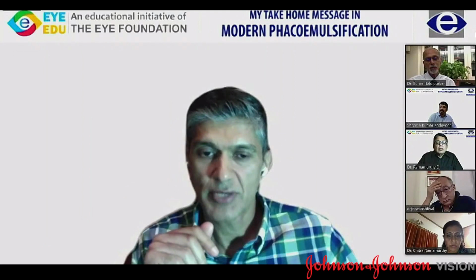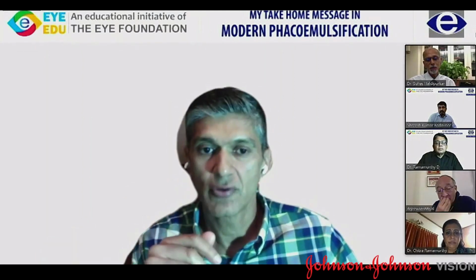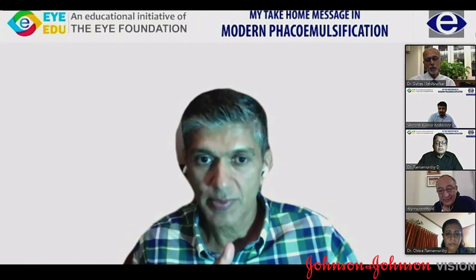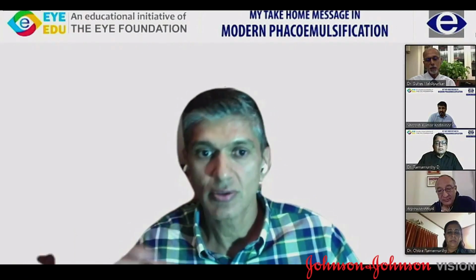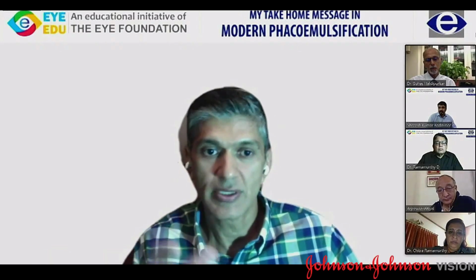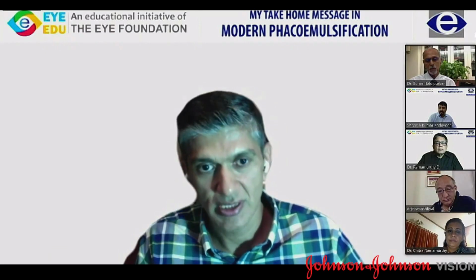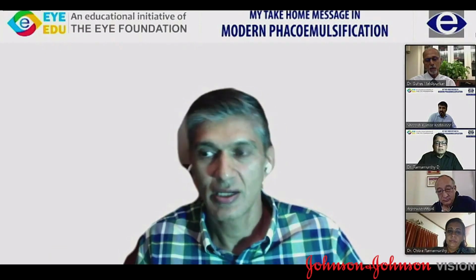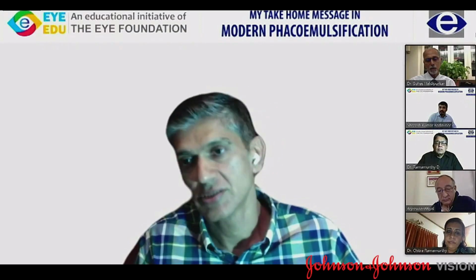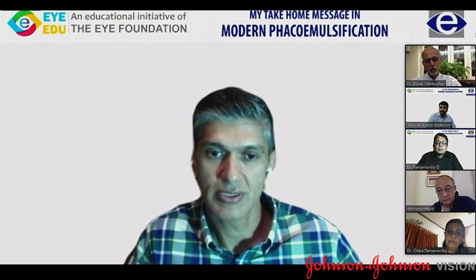I have a question. Sometimes we see patients coming in for a premium IOL, either a toric or a multifocal, and they've been operated previously for a pterygium with some residue, or a fibrotic or regressed pterygium. So how do you manage it? The pterygium itself is not bothering the patient. But when you want to do a premium IOL, you need to optimize the ocular surface before biometry. So this is a question which is always there.